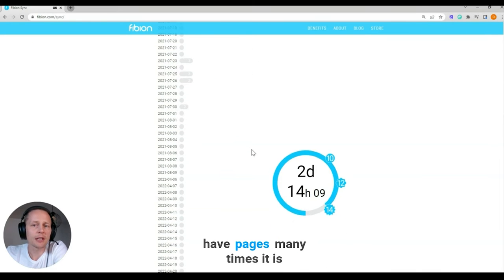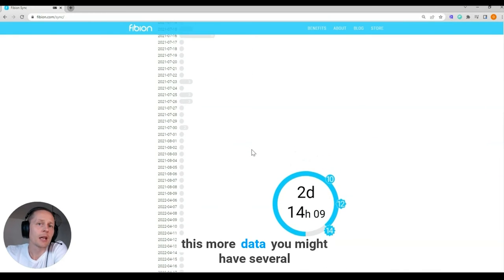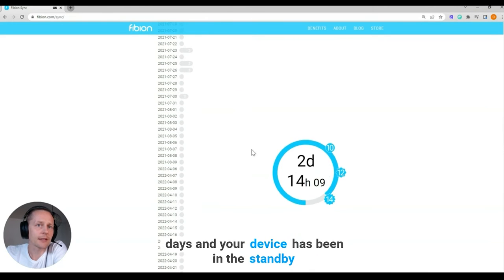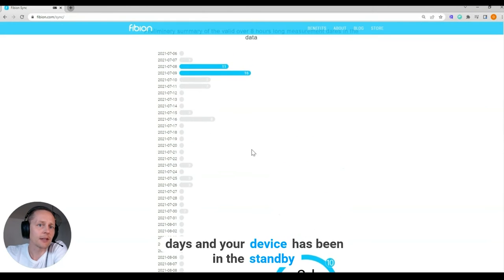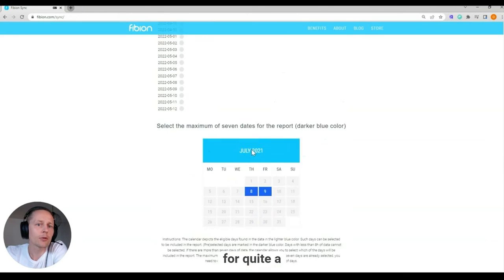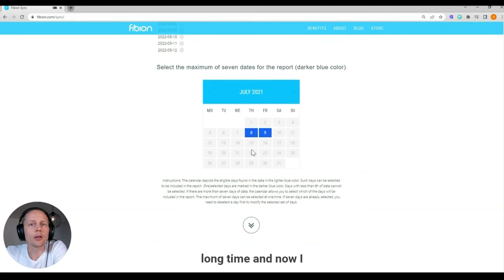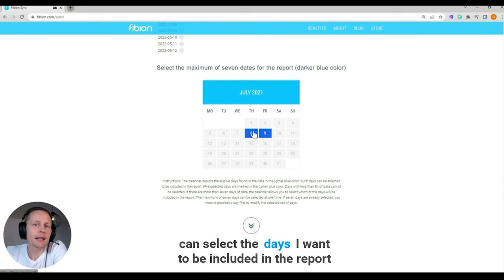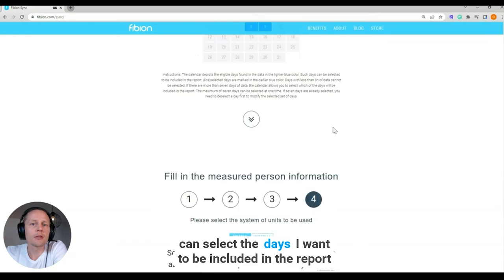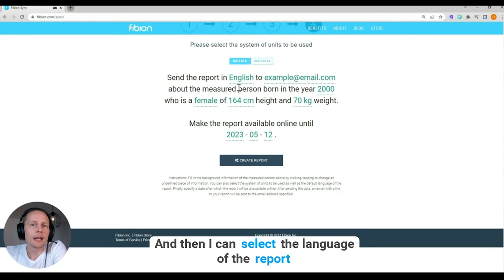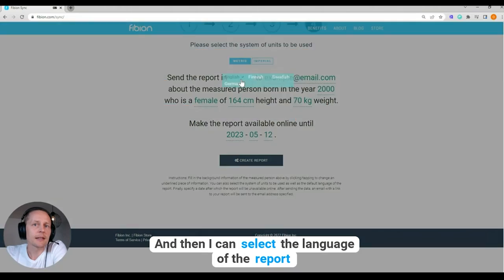Many times there is more data and you might have several days. Here the device has been in standby mode for quite a long time. Now I can select the days I want to be included in the report.